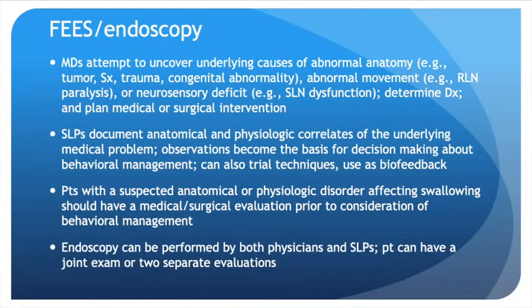So there's a little bit of a difference between doctors' use of endoscopy and speech-language pathologists' use of endoscopy. Medical doctors attempt to uncover the underlying causes of abnormal anatomy, so tumor, surgery, trauma, congenital abnormalities, abnormal movement, or neurosensory deficits. They want to determine a diagnosis and plan medical or surgical intervention. SLPs, on the other hand, document abnormal anatomical and physiological correlates of the underlying medical problem. So we have functional language that we use when we are describing what is going on. We don't talk about diagnosing things ourselves. Doctors diagnose, we assess function.